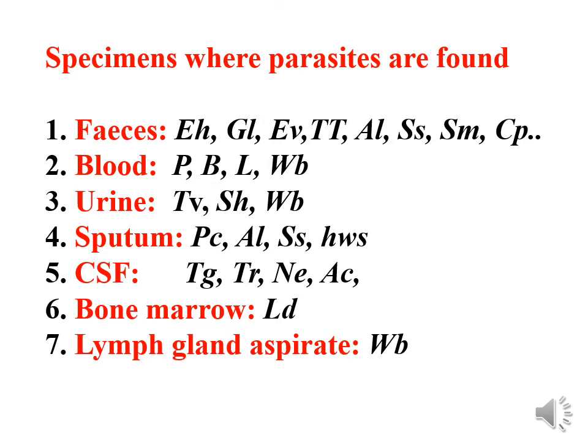In the lymph gland, the parasite that lives in the lymphatic system is Wuchereria bancrofti, the filarial worm, of course with other two species like Brugia malayi and Brugia timori, but the most important one causing elephantiasis and very prevalent is Wuchereria bancrofti causing Bancroftian filariasis. So they could be diagnosed by aspiration of lymph glands and to recover the snake-like structures known as microfilariae.